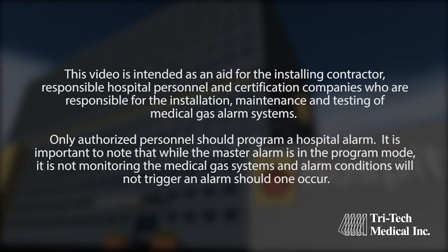Only authorized personnel should program a hospital alarm. It is important to note that while the master alarm is in the program mode, it is not monitoring the medical gas systems and alarm conditions will not trigger an alarm should one occur.